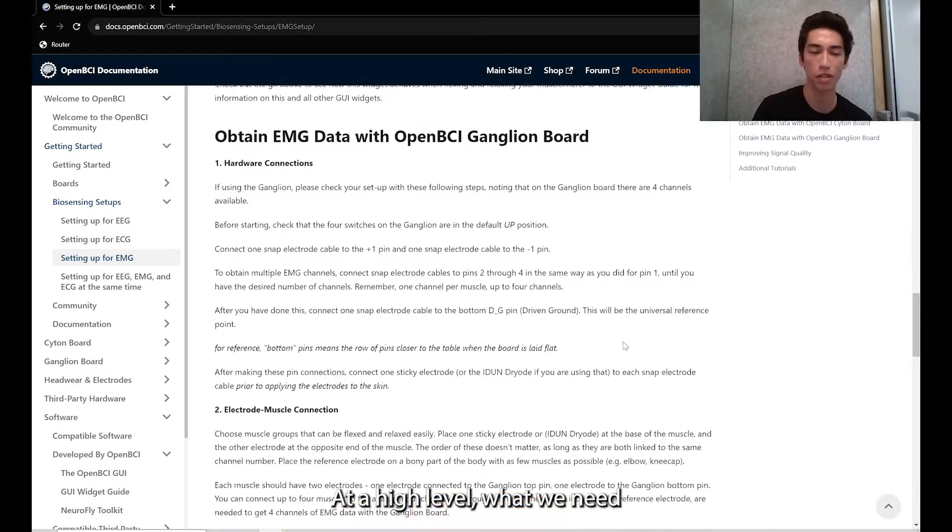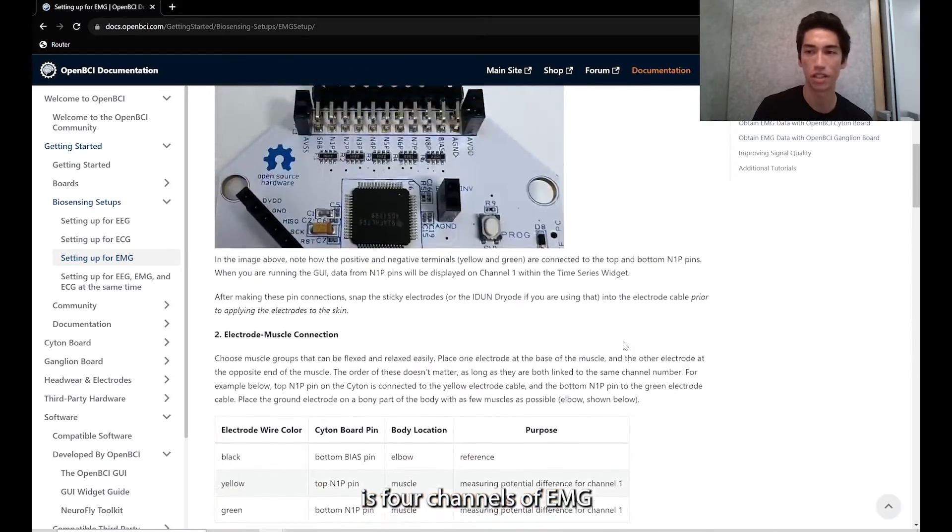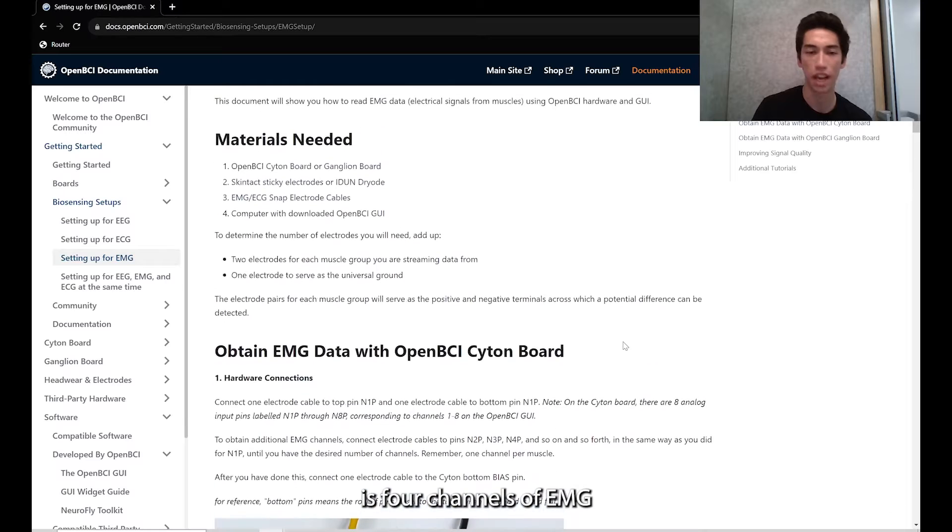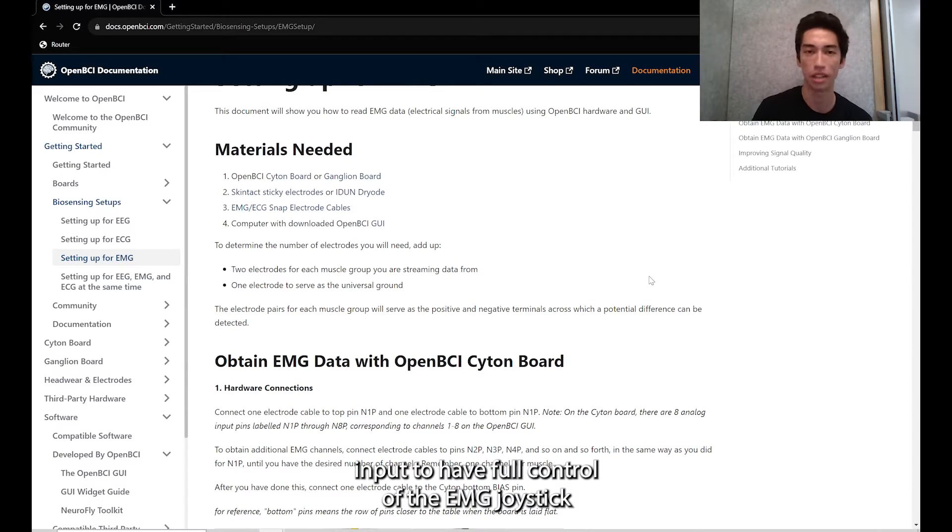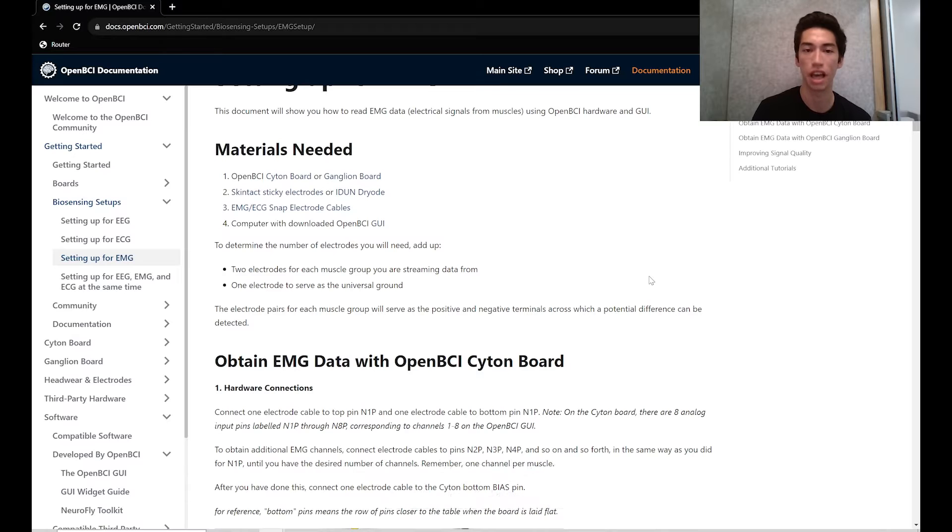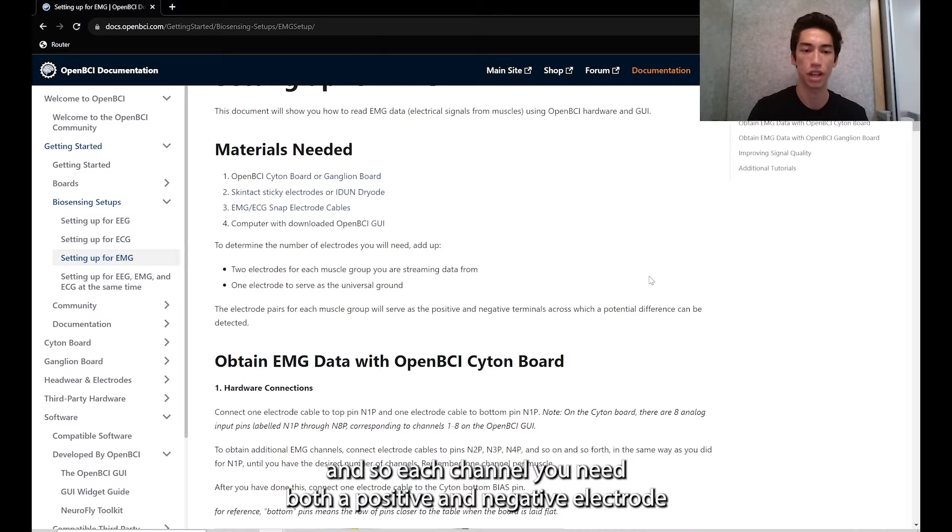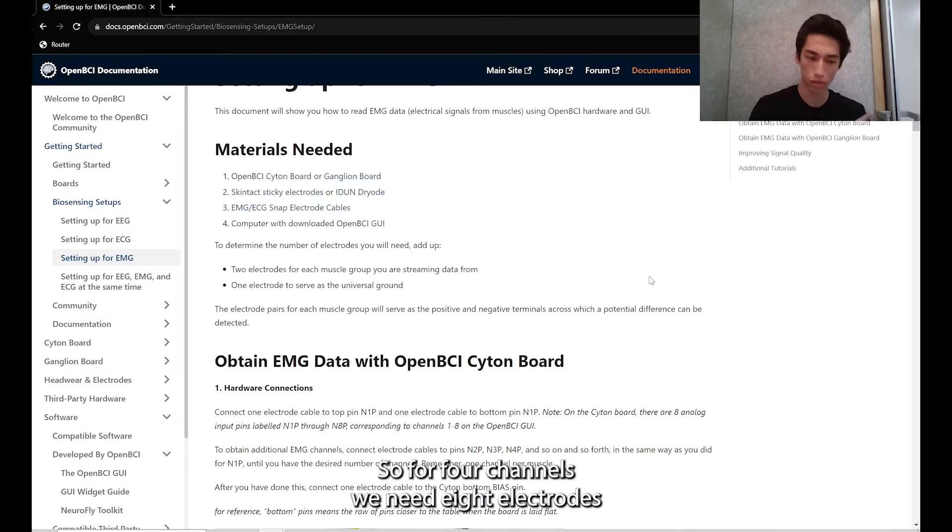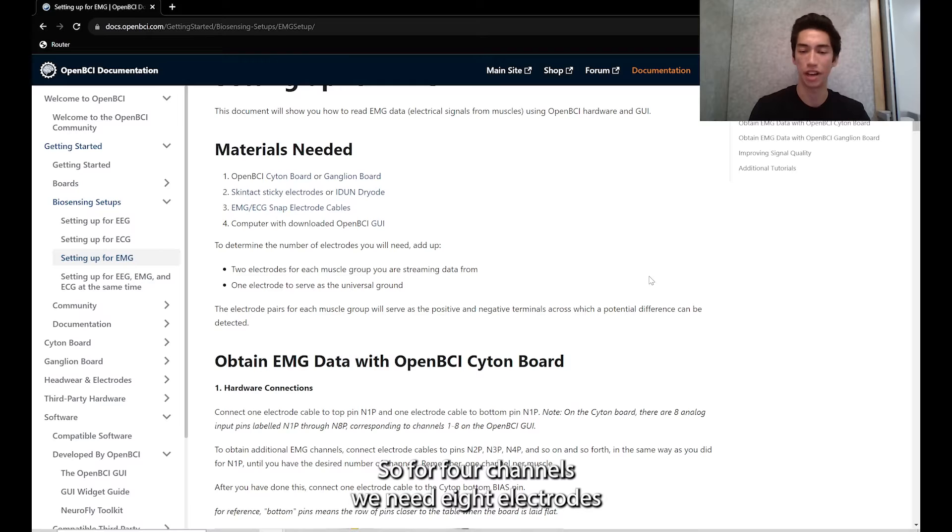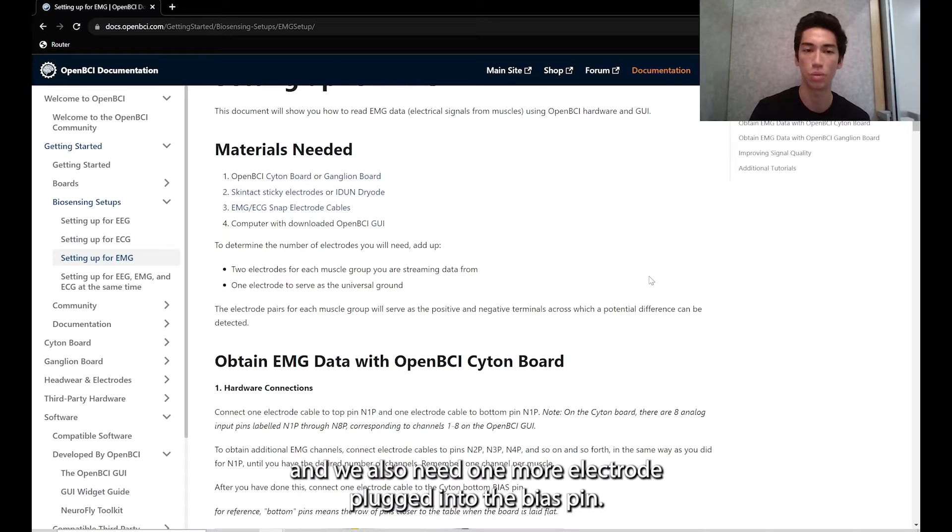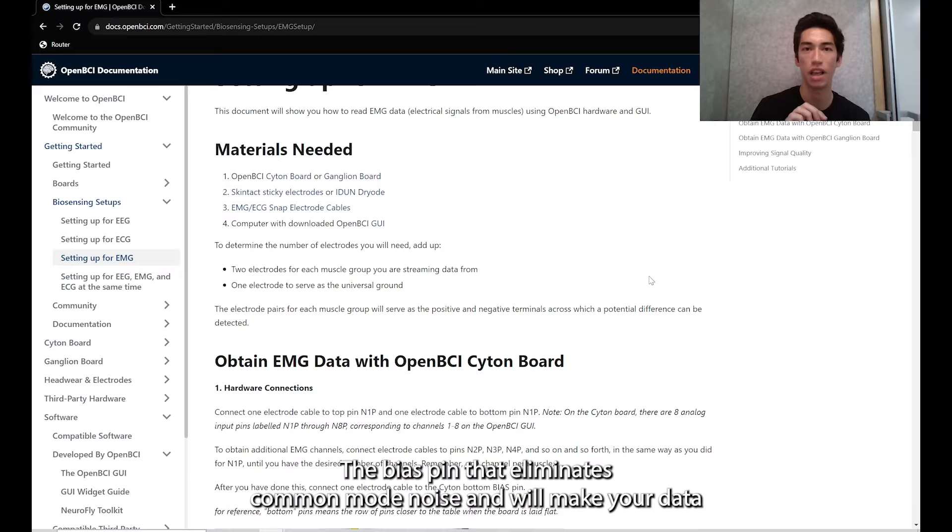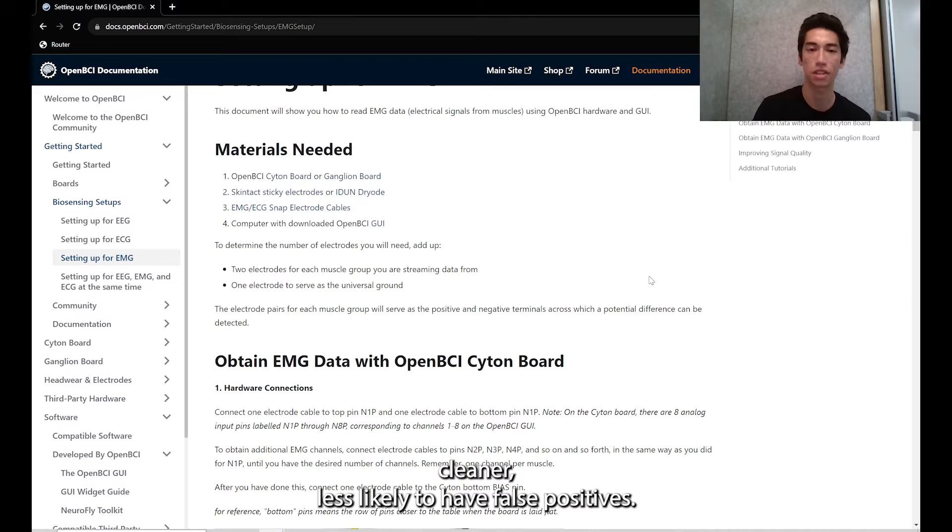At a high level, what we need is four channels of EMG input to have full control of the EMG joystick. Each channel needs both a positive and negative electrode, and the muscle activity is measured between the two. So for four channels, we need eight electrodes. We also need one more electrode plugged into the bias pin. The bias pin eliminates common mode noise and will make your data cleaner, less likely to have false positives.